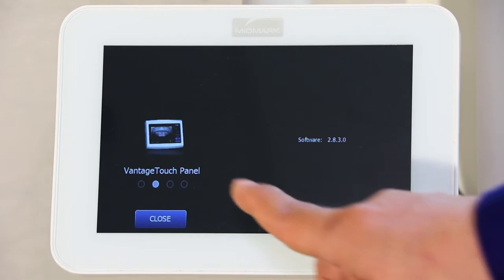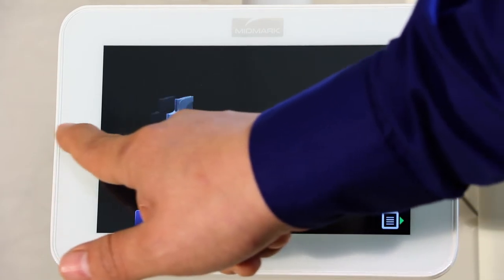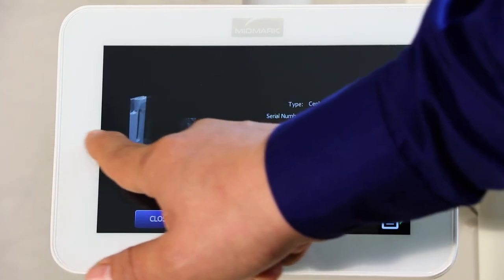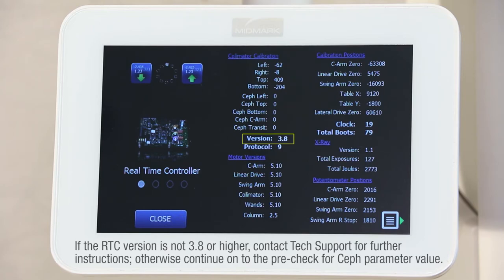Starting from where you checked the Device Suite, verify that the RTC version 3.8 or higher is installed. Place your finger on the image and slide it left or right until the Real-Time Controller is displayed, and look for the RTC version number as indicated. If the version is not 3.8 or higher, contact Tech Support for further instructions. Otherwise, continue on to the pre-check for Ceph parameter value.